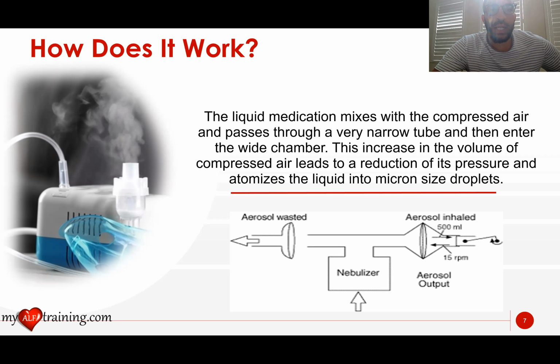I know this is more physics, but just so you can have an idea of what's going on, and how this nebulizer turns liquid into smaller droplets, small enough to flow with air. And this is just a diagram of what happens.